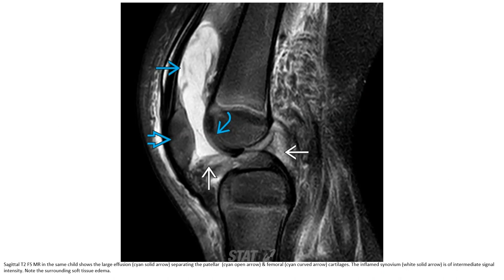This is a T2-weighted MRI in the same patient. There is a large effusion separating the patellar and femoral cartilage. The inflamed synovium is of intermediate signal intensity. Note the surrounding soft tissue edema.